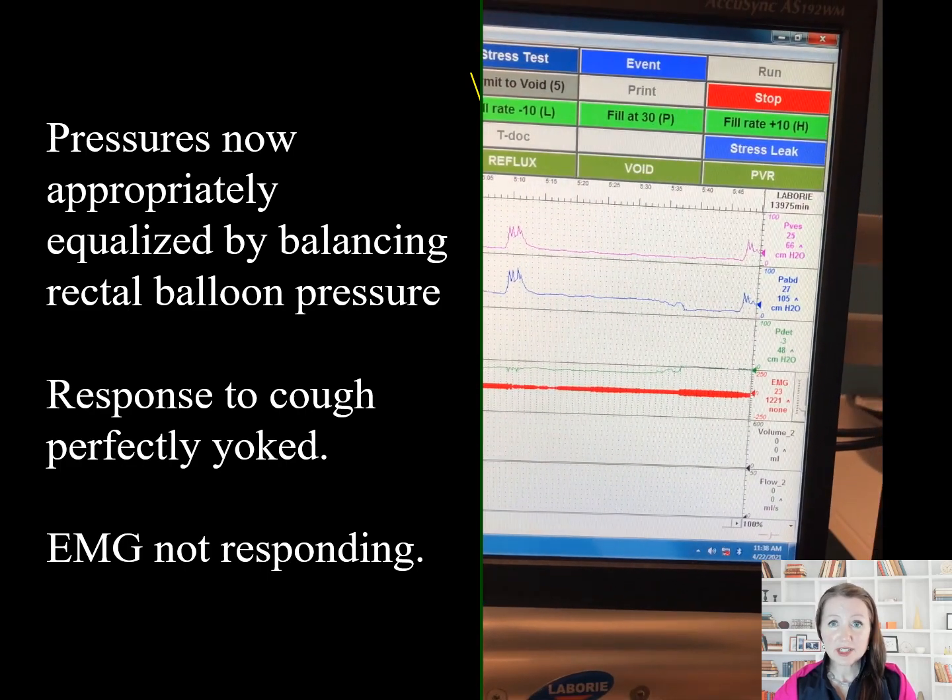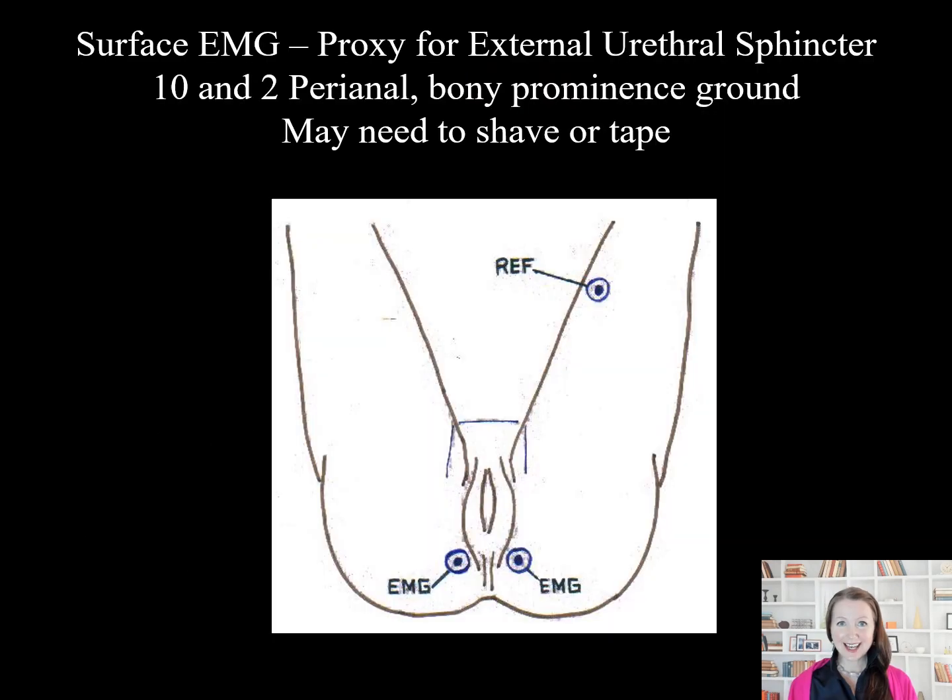The patch EMG is not responding with a proper guarding reflex. Surface EMG is a proxy for the urethral sphincter but really measures the partially yoked anal sphincter. Patches are placed at 10 and 2 o'clock right next to the anal sphincter. A reference patch is placed overlying the femur near the knee. Needle EMG and oscilloscopes are more accurate but less commonly used.